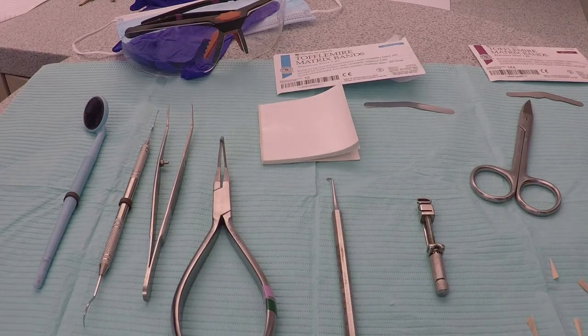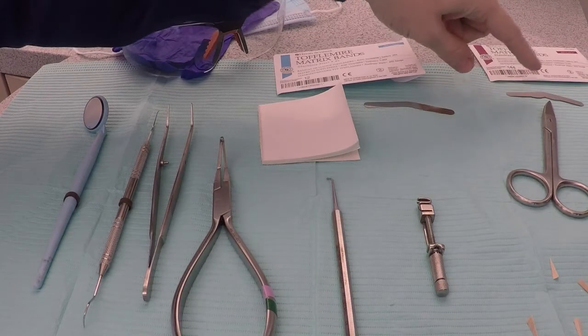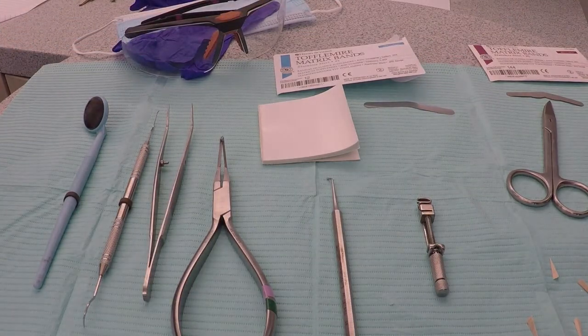If we are going to be using an extension matrix band, we should also have some scissors out in case we need to adjust a proximal extension.